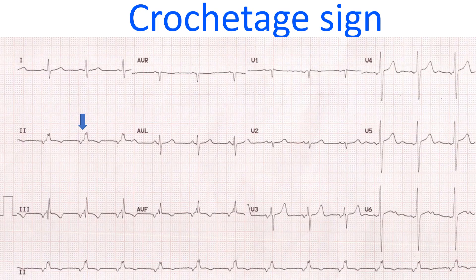In addition, the ECG also shows an intraventricular conduction defect in the form of a notched wave in leads 2 and AVF, and an RSR prime pattern in lead 3. Sometimes this pattern occurs in atrial septal defect and it is known as the crochetage sign.